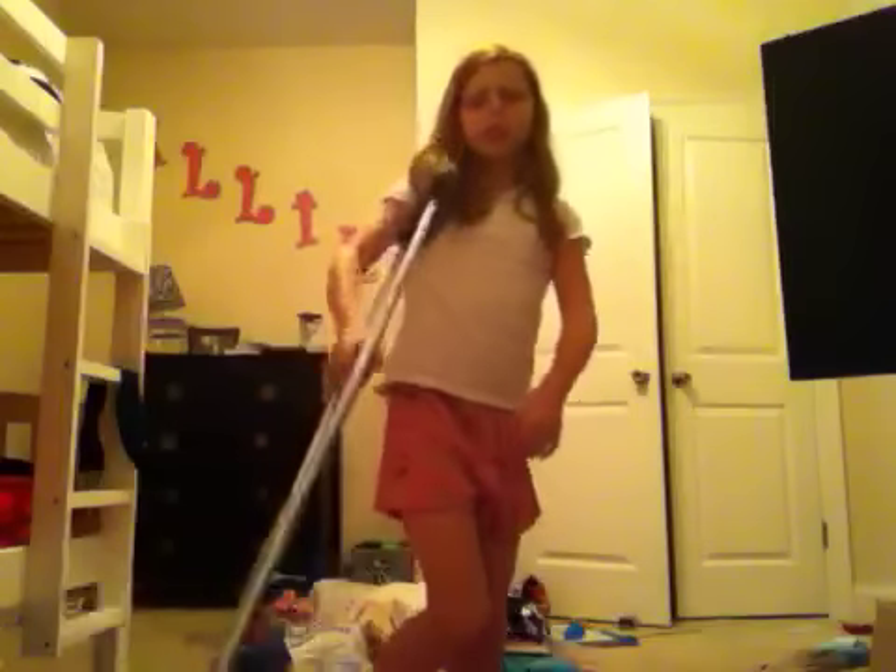Hey, this is a video on how to use one crutch. As you can see I have two crutches, but my foot got better and I can walk on it a little bit, though it still hurts. It's getting better. Someone asked me to show how to do this, so I'm going to show you. I'm in my pajamas, but here we go.